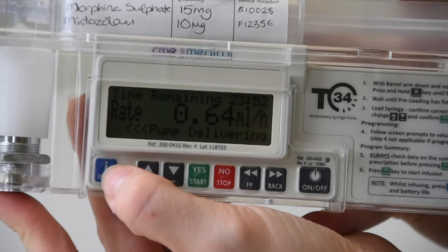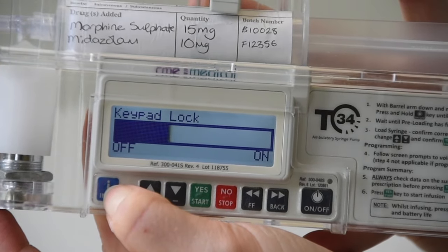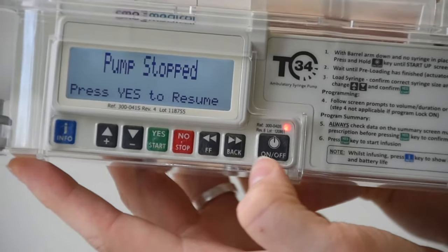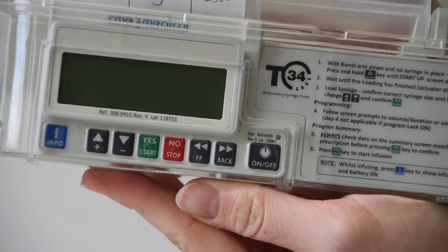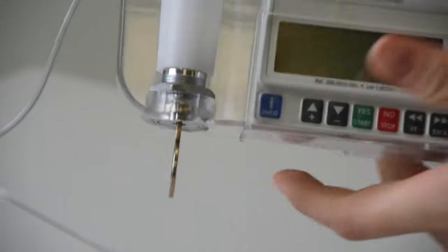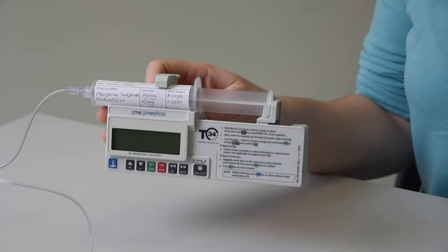Unlock the keypad by pressing and holding down the info button and wait for the beep. Press the stop key, press and hold the on and off button. Disconnect the syringe from the line, then remove the syringe from the pump, and you are ready to start again with all of the checks from the beginning.